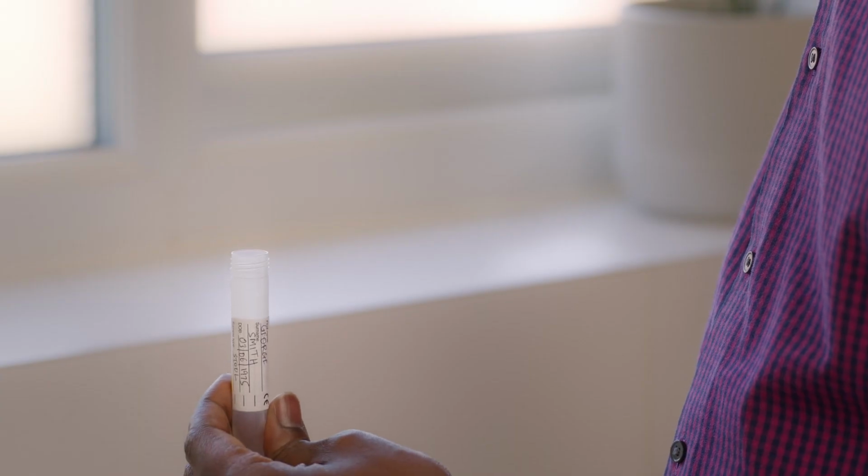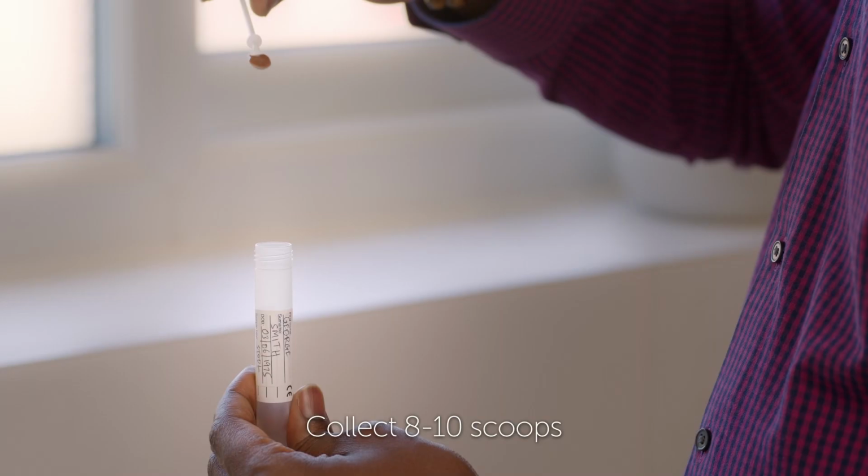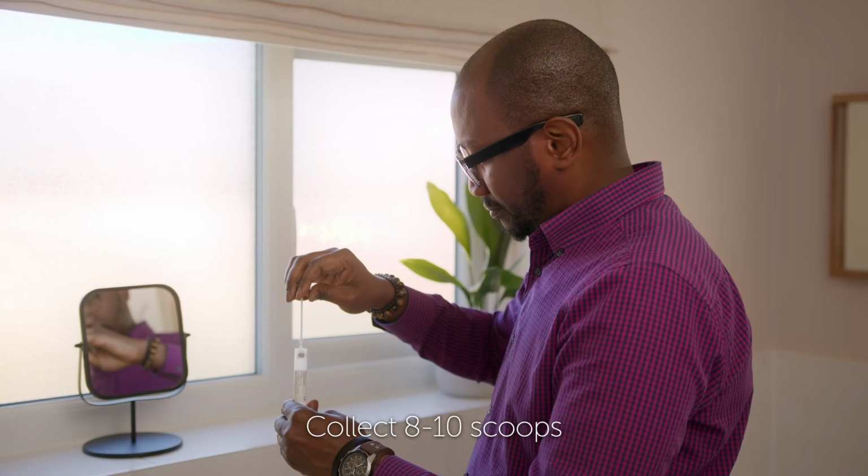If you've got one of the plain tubes with a small spoon, just use it to put 8 to 10 scoops of stool into the tube. Make sure to screw the lid back on firmly when you're done.